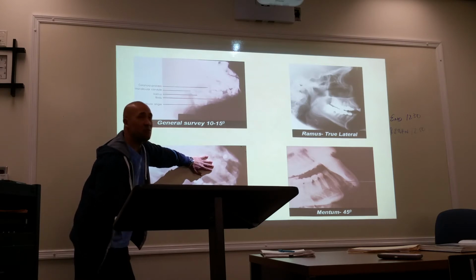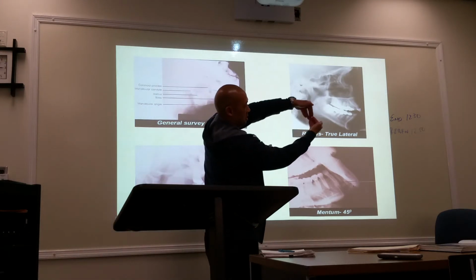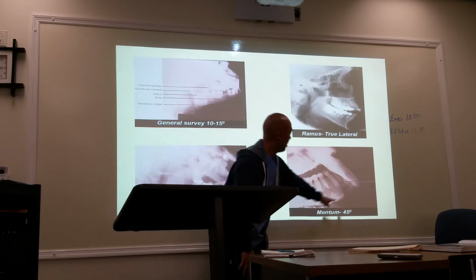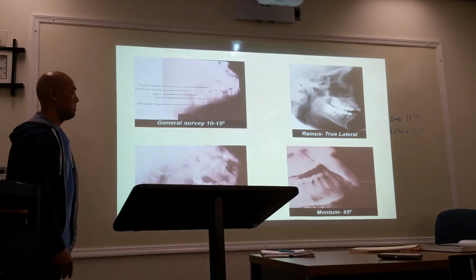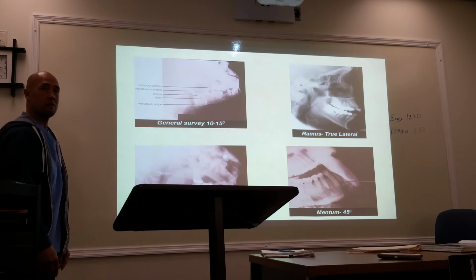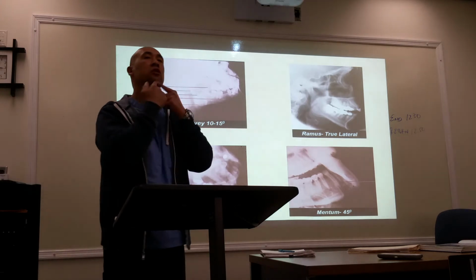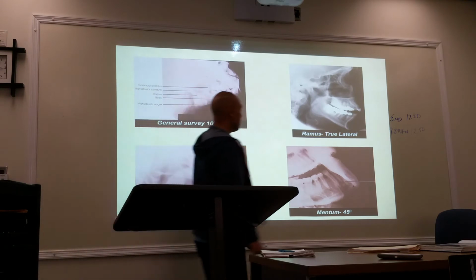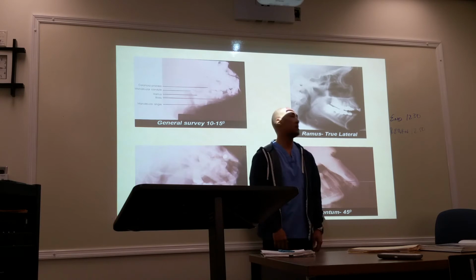Okay? And then even steeper, because now what we're doing is this. Even with a steeper rotation, now we can see the mentum. Is the mentum the same as the mental point? The mentum is just the general area. The mental point is actually where the two bones fuse. A tilt, not a rotation, right? This is a rotation for you. This is going to be this.